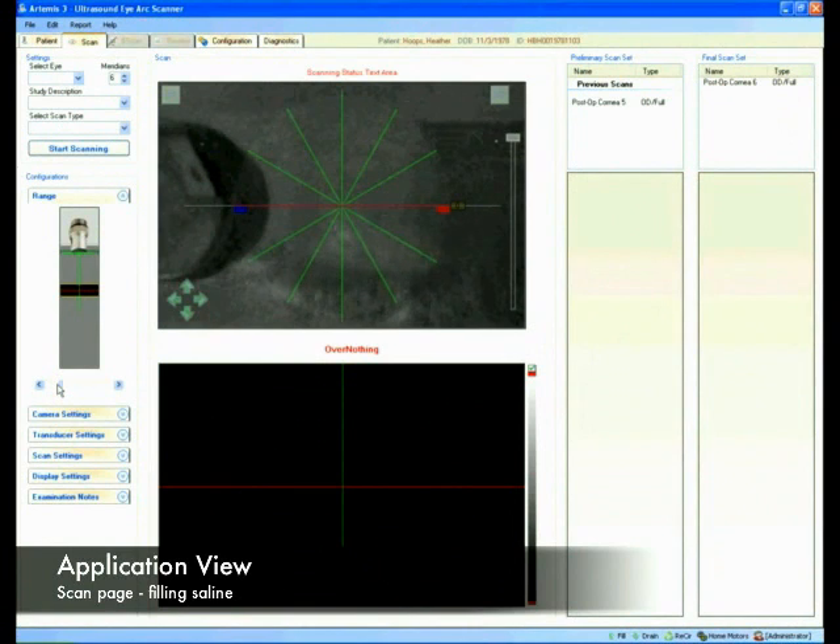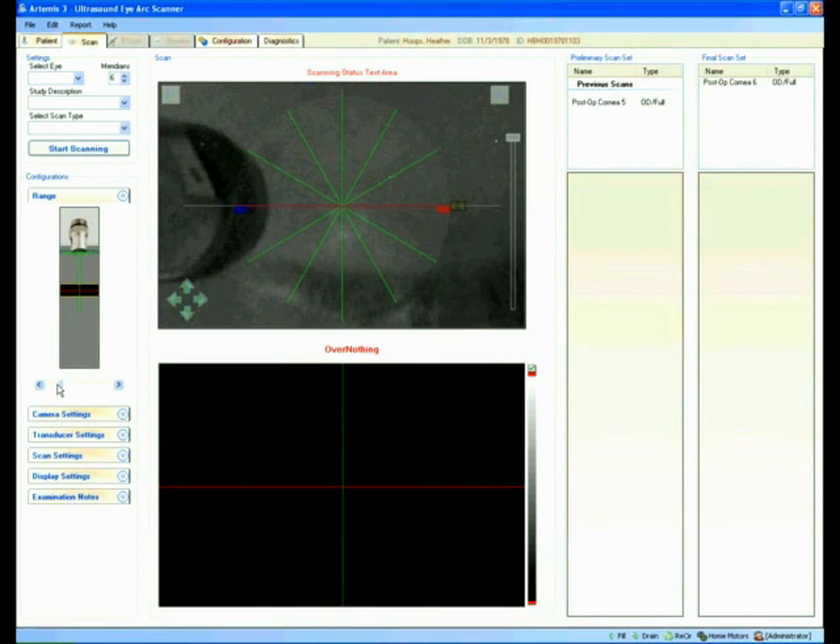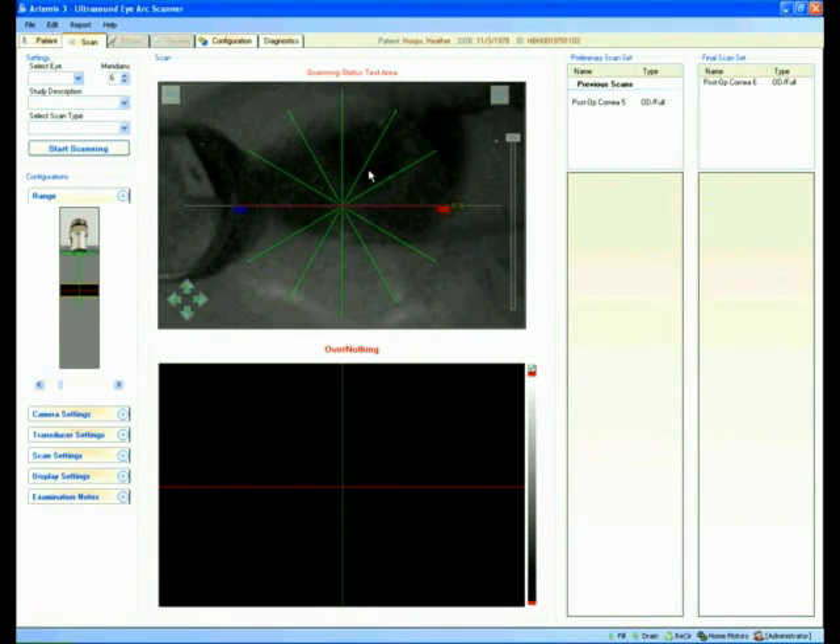We can see the saline filling on the video, and that's just about full. It takes a couple of seconds for the temperature of the eye to equalize with the temperature of the fluid, so the patient just leaves her eye closed. Whenever you're comfortable, open your eye.